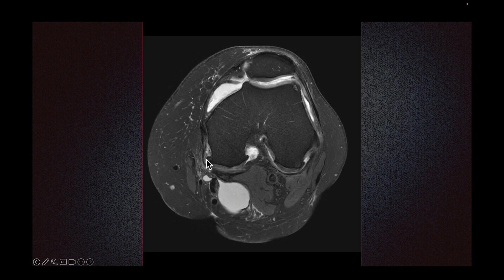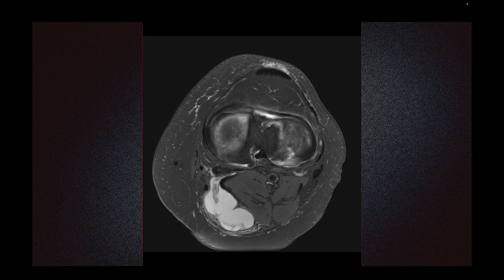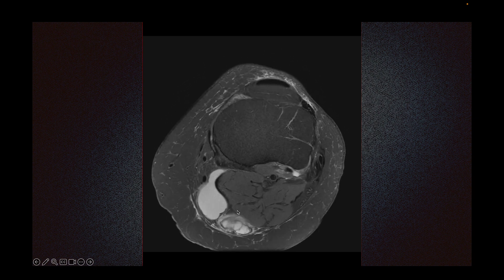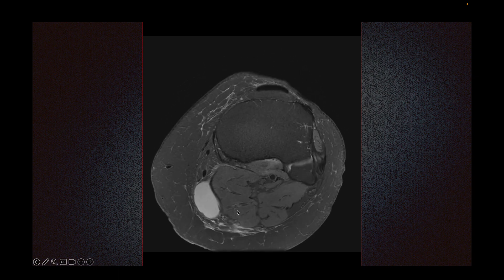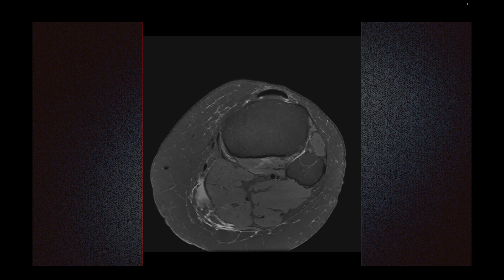This person also has degenerative changes and joint effusion, which we will not focus on. There is some debris and septation in the cyst. As we scroll down, we see edema around the cyst. This indicates that the cyst has leaked or ruptured, and sometimes this can cause pain.